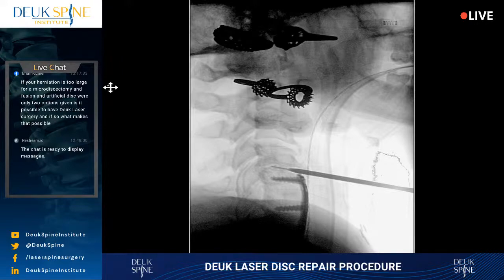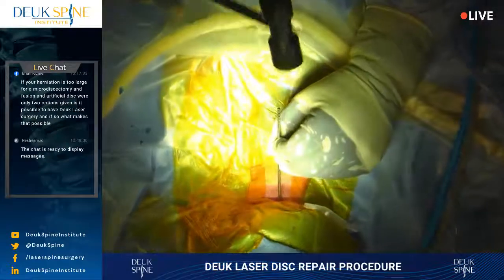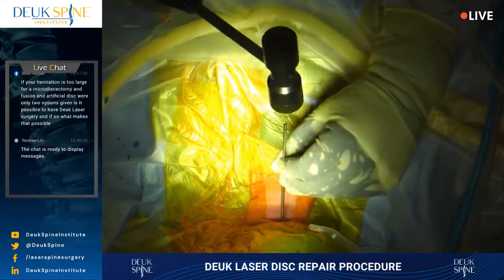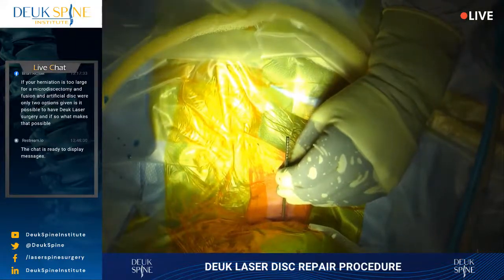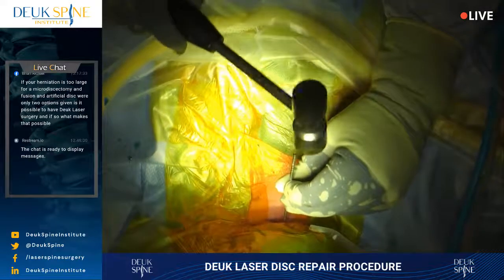Yeah, thank you. So we're going to continue to advance the dilator through the disc. Now this surgery is called transdiscal because we're literally going through the disc. Trans means across. We're going through her disc to get to the herniation in the back.